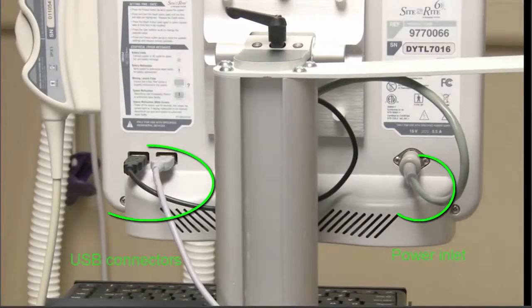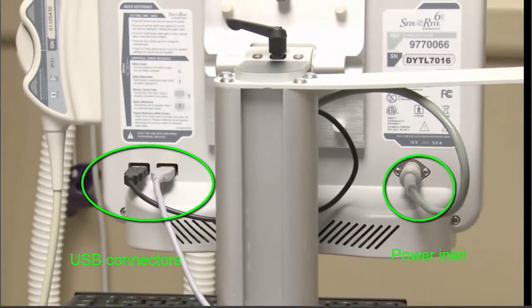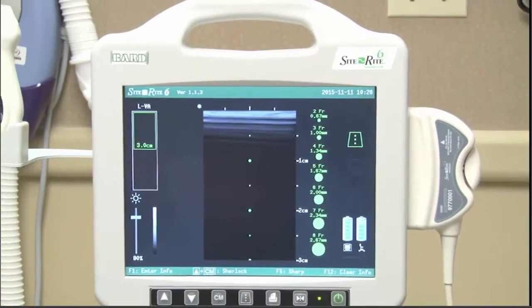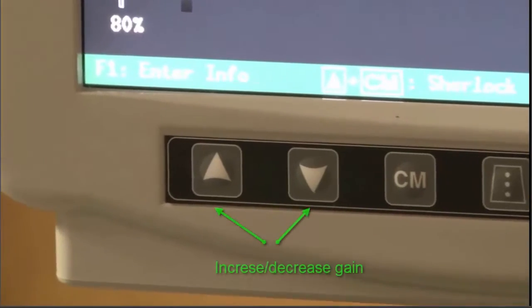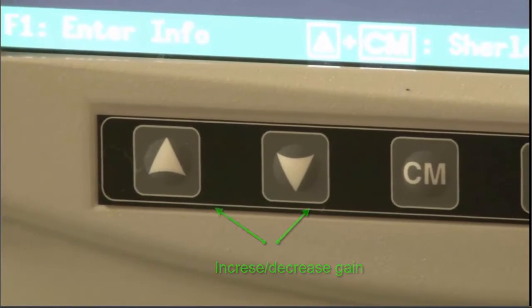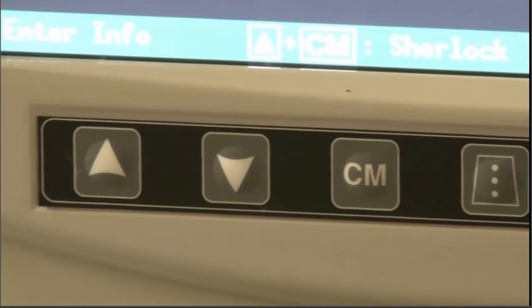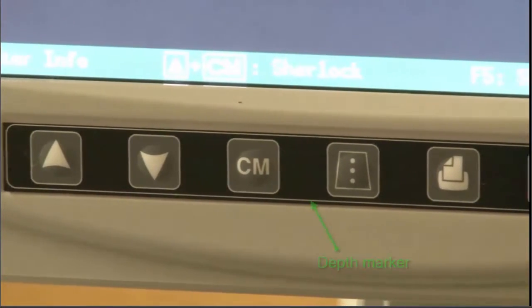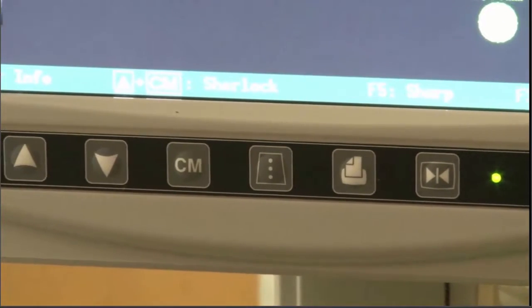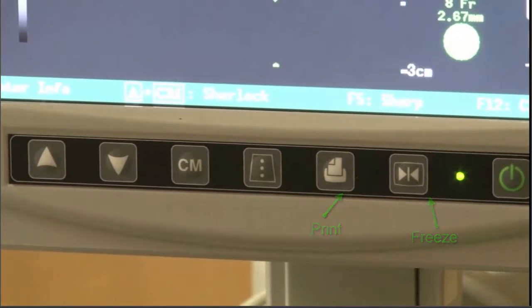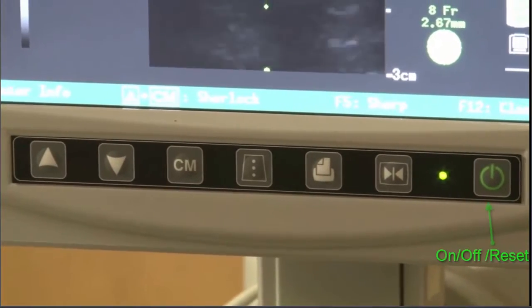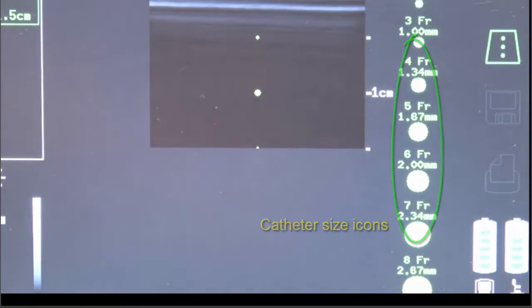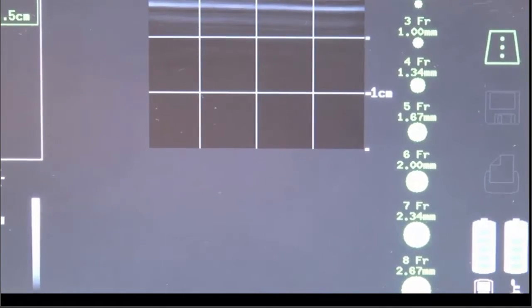The back panel consists of USB connectors and power inlet. The icons under the display screen include gain, depth, depth markers, printer, freeze, on and off, and reset. Catheter size icons are displayed in proportion to the vessel image at a selected depth.